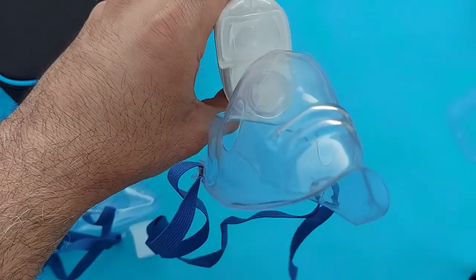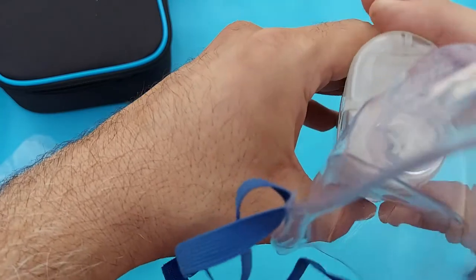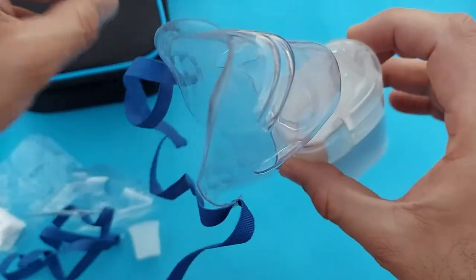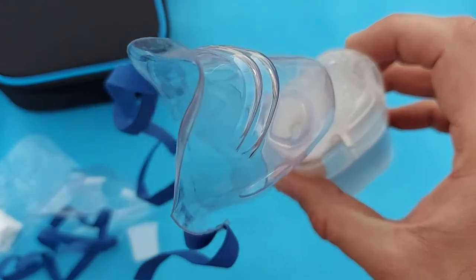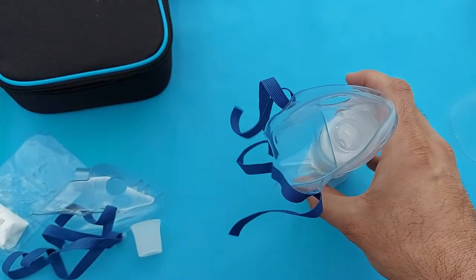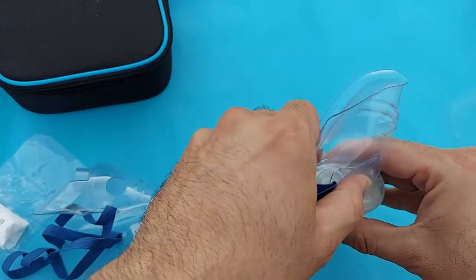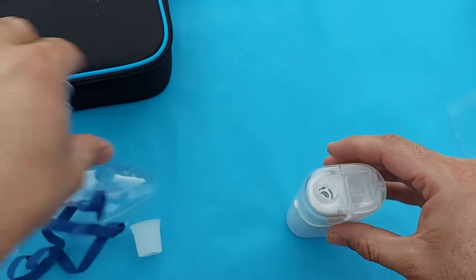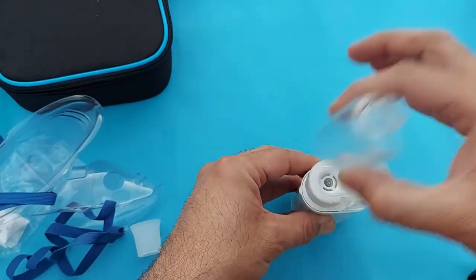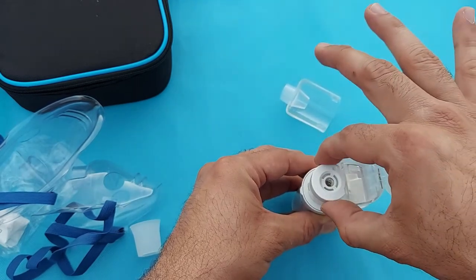If the device is not working properly, make sure to hold it at 45 degrees so the steam will start. This is very easy to use at home — it is comfortable, easy to use, and easy in maintenance and cleaning. Now you can remove this part, open the medication container, and take out the mesh cap very carefully.